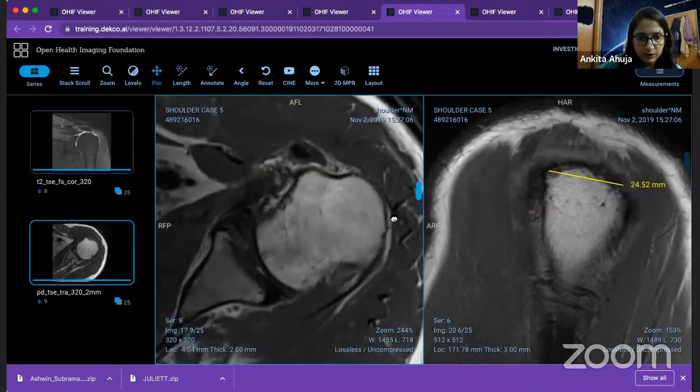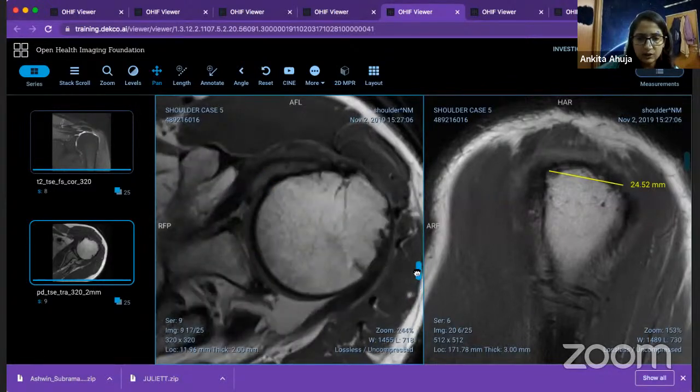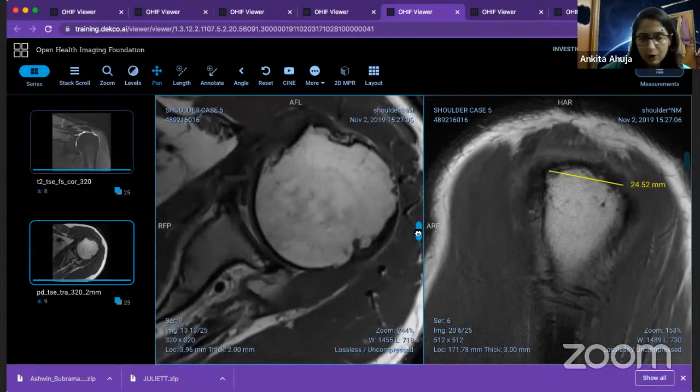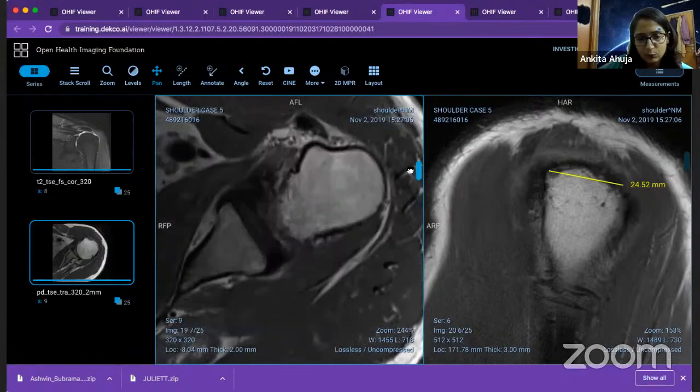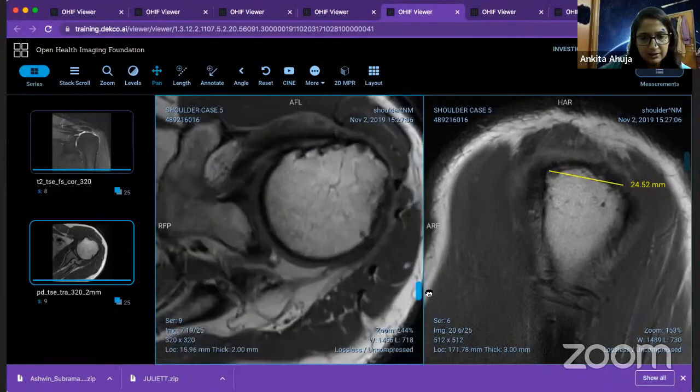So we have covered the rotator cuff. Biceps also we looked at simultaneously. Now quickly having a look at articular cartilage and labrum. I'm just not missing steps in every case, because that gives us an approach for how to go for a case and we don't miss things. Although in this case, I think nothing else would matter because you know what you're dealing with predominantly. But still, there are certain findings.